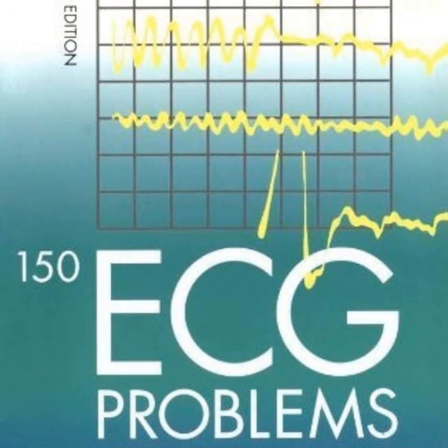When a patient is on a therapeutic dose of digoxin, you'll frequently see this characteristic downward-sloping ST segment depression. It looks almost like a sagging scoop, right? Or like a reverse tick mark. The reverse tick mark, exactly. But here's the thing. Spotting the drug effect is one thing. The critical clinical pearl here is spotting the catalyst that's pushing that therapeutic dose over the edge into toxicity.